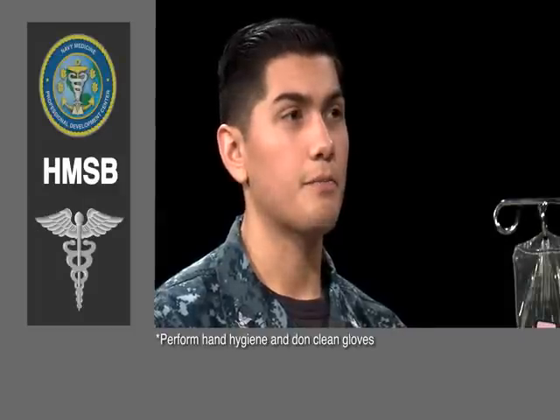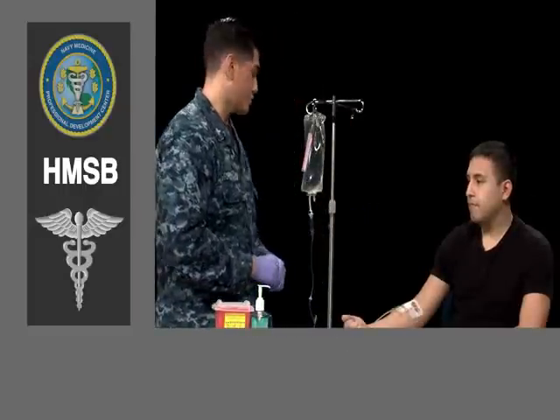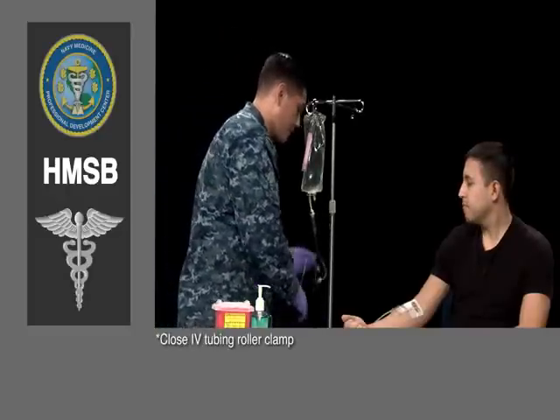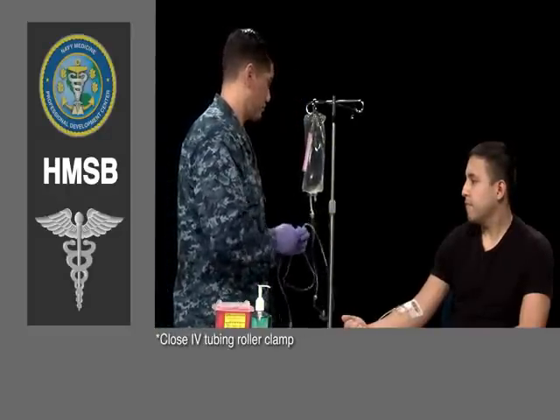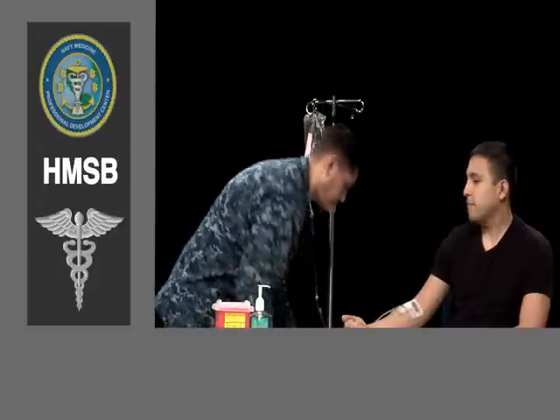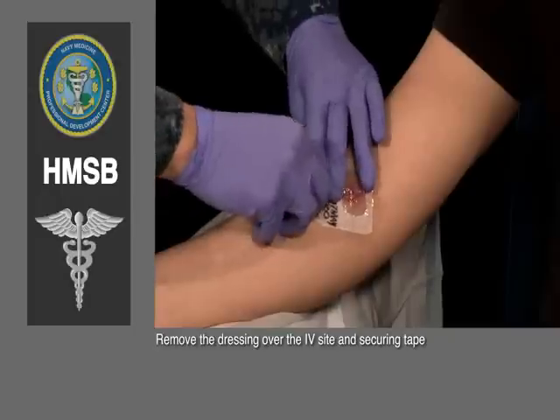Before going any further, I'm going to perform hand hygiene and don clean gloves. I'm going to start the procedure by first clamping the tubing line. Next, I'm going to remove the transparent dressing and the tape.